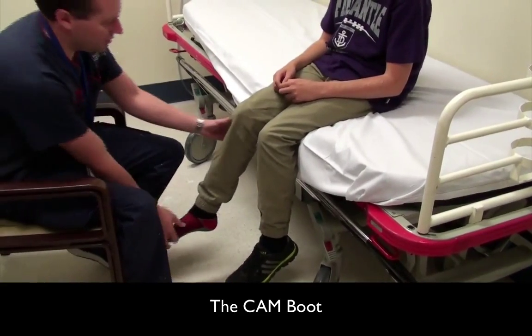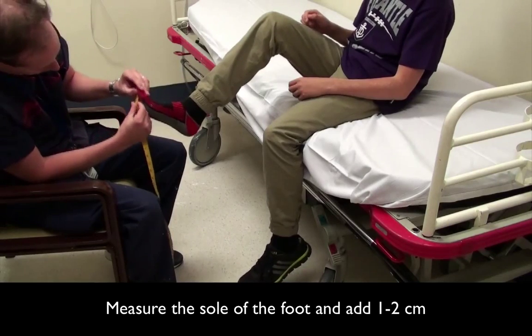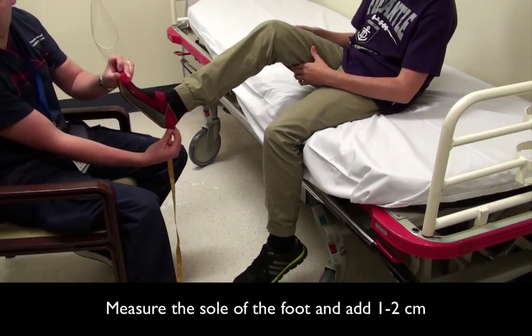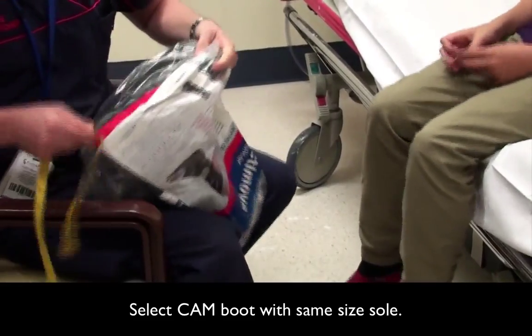Cam boot application. For the cam boot, measure the sole of the foot and add approximately 1 to 2 extra centimetres. Measure the sole of the cam boot to select the appropriate size.